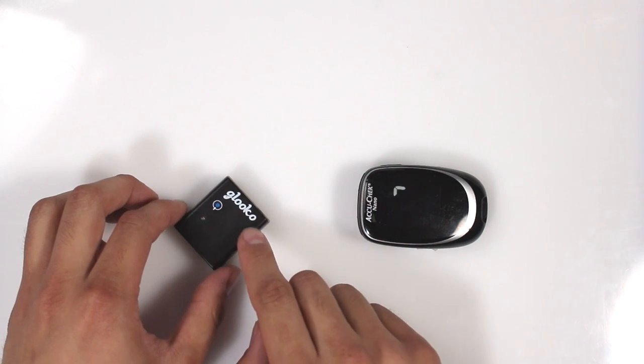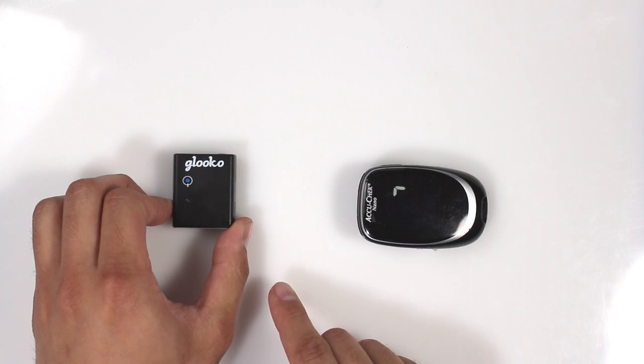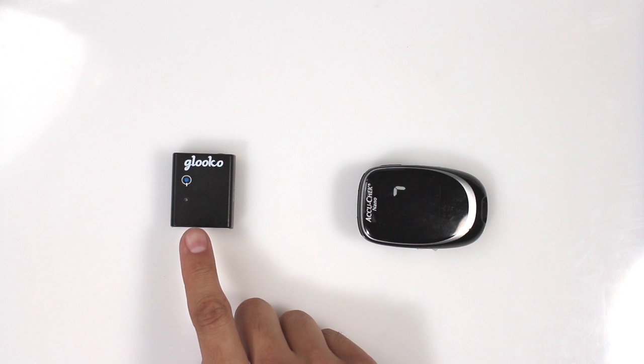Turn Glucometer Sync Blue on by pressing and holding the Power button for at least one second. You'll know you've done this correctly when you see a flashing green light.